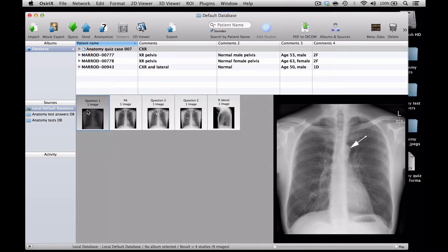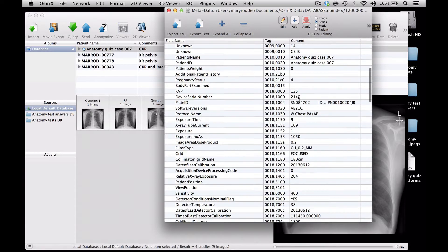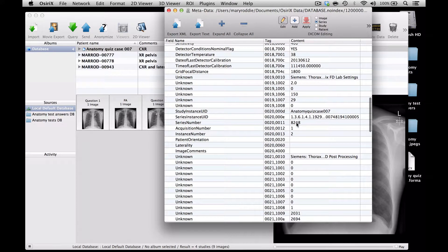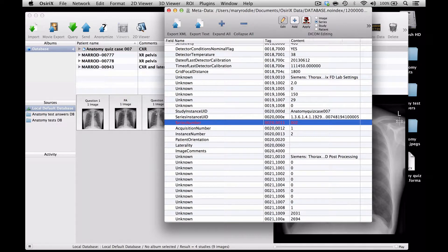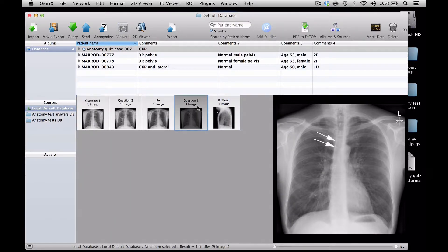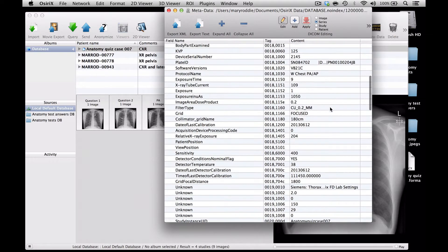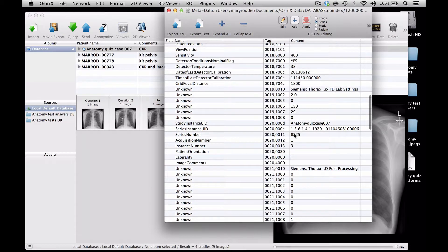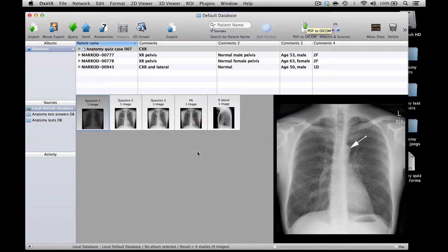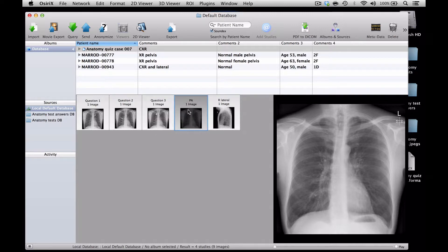You'll see now that Question 1 has gone to the beginning of my series. If I go to Question 2, I do exactly the same thing — press the Edit button, go down to the series number, change it to 002, and apply. Similarly with Question 3. So I've now got my questions in order for the candidate. I've got the original image with no annotations on and I can add as many more images as I like.